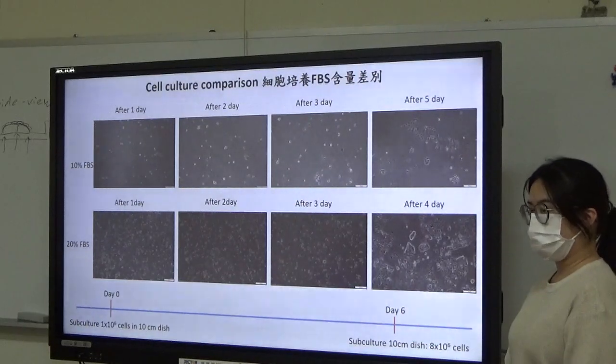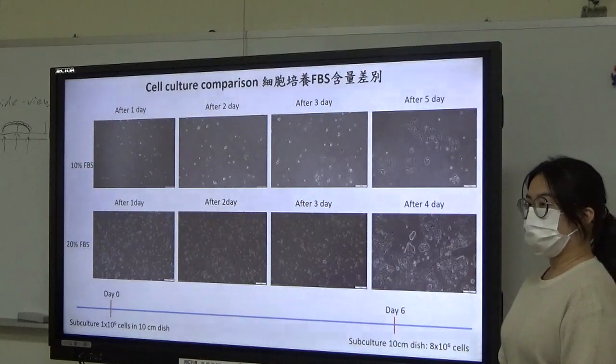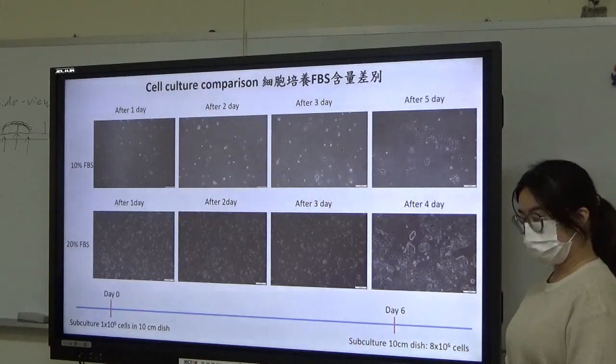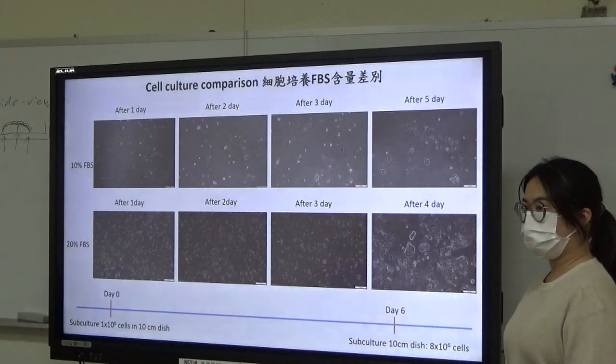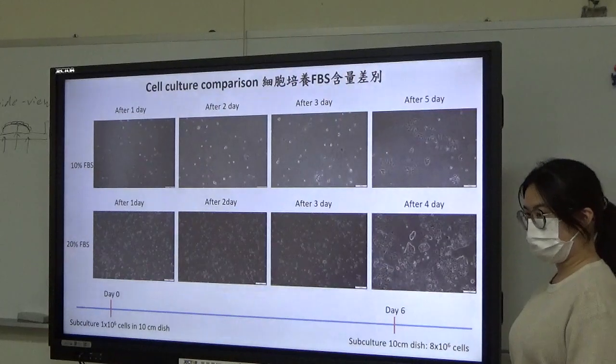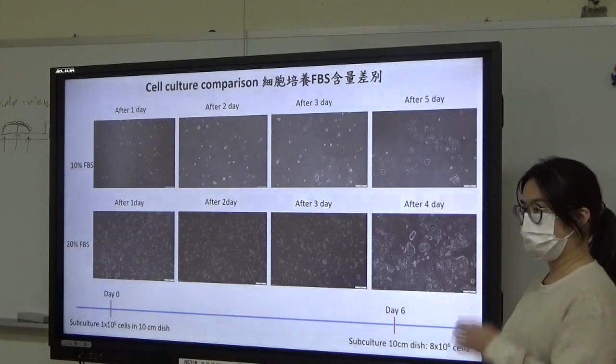So they need a huge volume of nutrients. With additional non-essential amino acids, you can induce more proliferation using the Caco-2 cells. And this is a cheap solution.